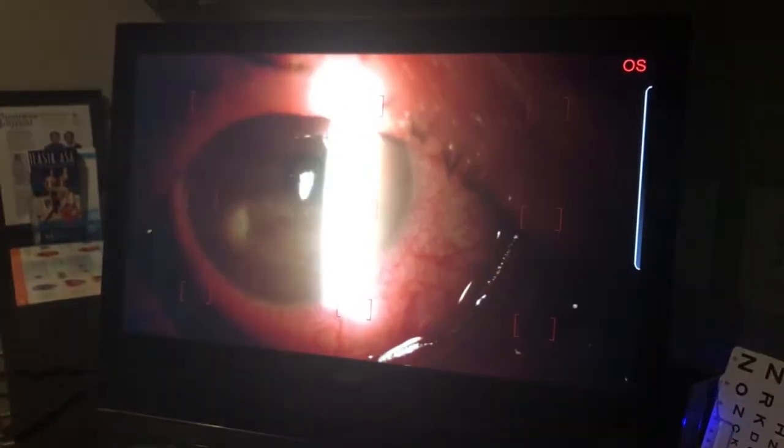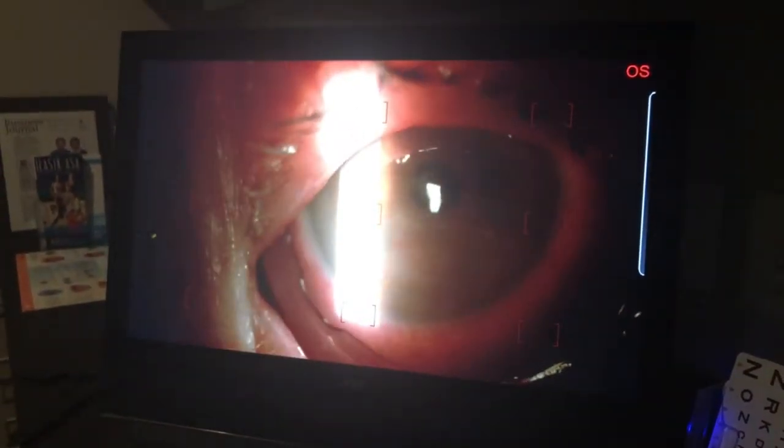The patient is very comfortable with the technique I just showed you — it takes a few seconds. And even without numbing, the patient tolerates it very well. Look down, Linda — you can see the upper edge of the ring is under the upper lid, right there.